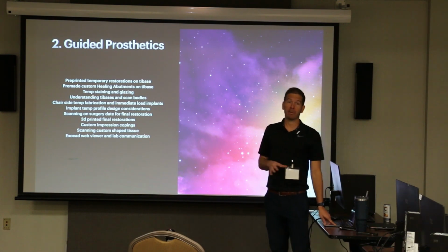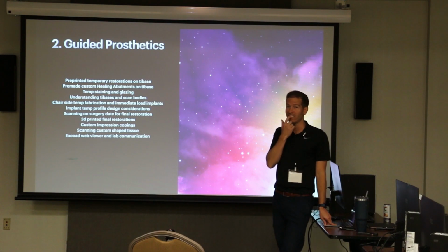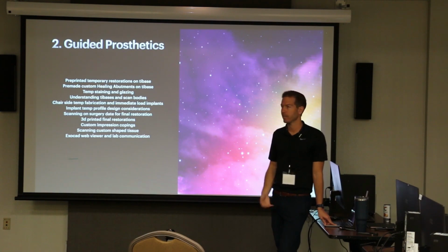How do you do a chairside pickup for an immediate load temporary on an implant? That's an important topic for patients that want to leave. I mean, for a central incisor nowadays, people don't really love flippers. So if you can give them an immediate implant, you can put a tooth on it that same day. It's a great service.